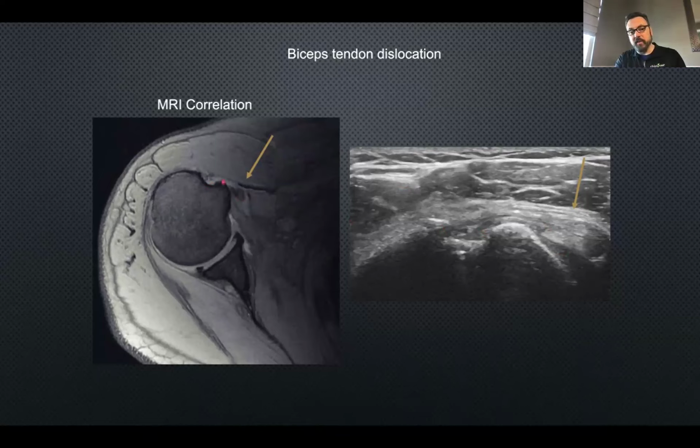One of the worst case scenarios you could have is this thing actually dislocating and wrapping around and ending up in the joint, which could be very painful for the patient. And one case I did see while at a seminar was it actually went lateral and ended up behind the humeral head, which is kind of crazy to think about.